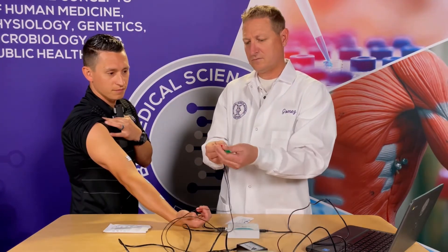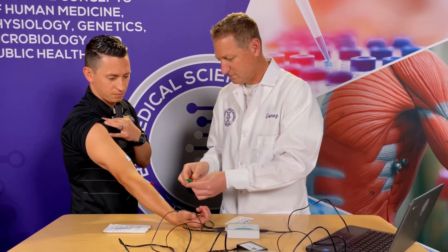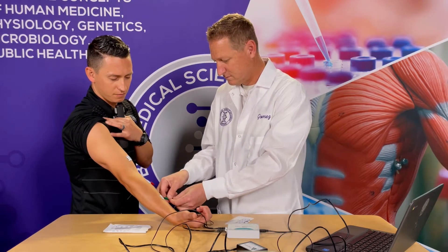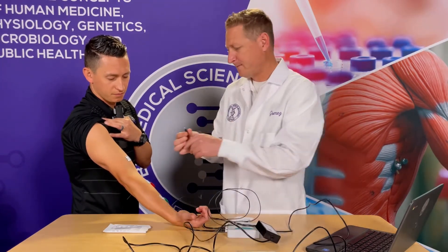Attach the third tab to the upper arm. Attach the red and green leads to the tabs on the forearm — for this lab, the red and green leads are interchangeable. Attach the black lead to the tab on the upper arm.